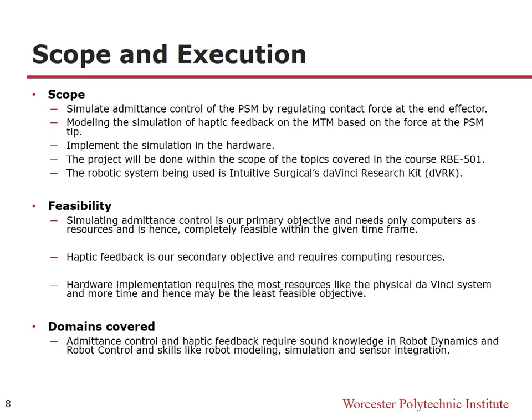Moving on to the scope of the project, we would like to regulate the contact force experienced by the end effector in order to simulate admittance control. Secondly, our interest lies in using the force at the PSM tip to simulate haptic feedback onto the MTM. Thirdly, our overachieving goal would be to implement the simulation on Intuitive Surgical's DaVinci Research Kit available in the AIM lab. The project will be done within the scope of the topics covered in the Robot Dynamics course.